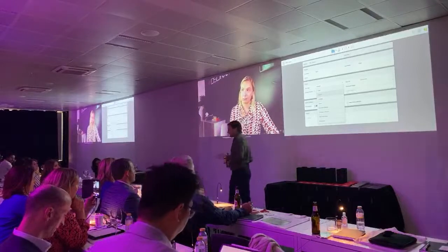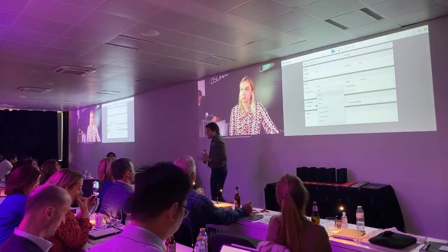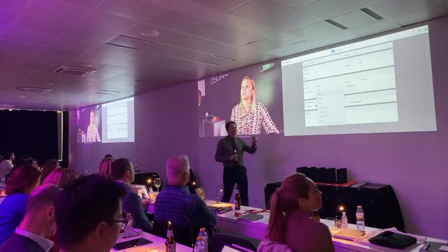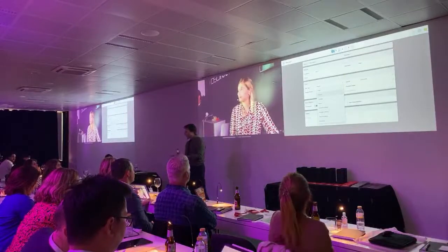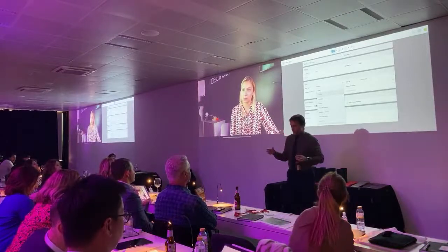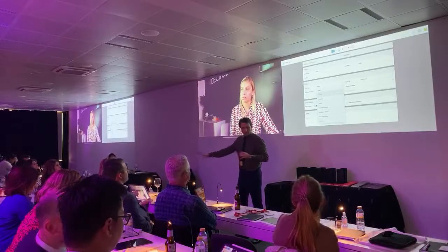The other type of quality is digital orthodontic workflow. The scanners that are great for that, better than others. The other one is implant workflow. The other one is restorative workflow. And the other is chair-side restorative workflow. And the 5th is chair-side solutions. Okay? So we can definitely see, and be honest here, for example, today still, CEREC is still leading the chair-side workflow. Yes. Still leading the chair-side workflow.